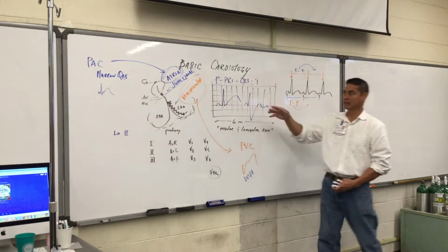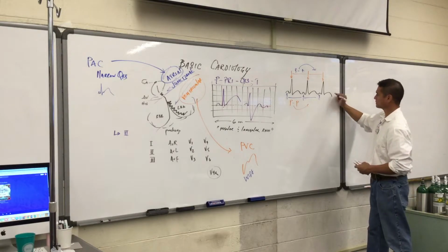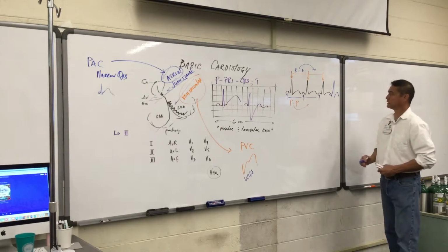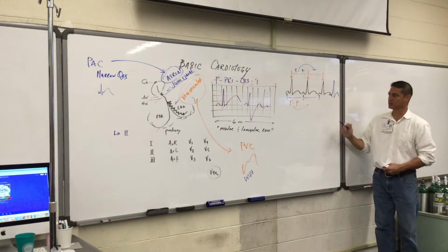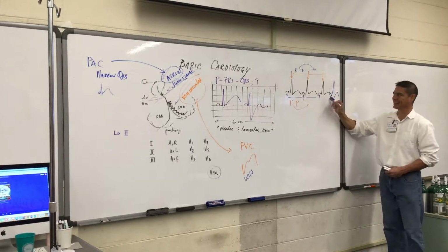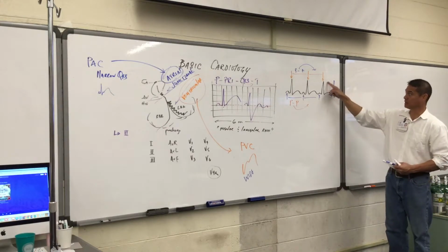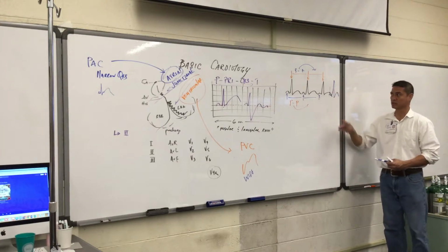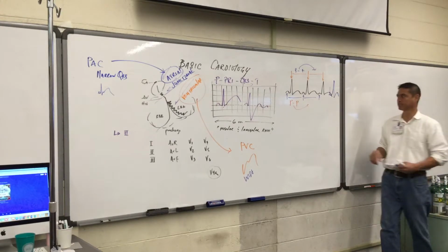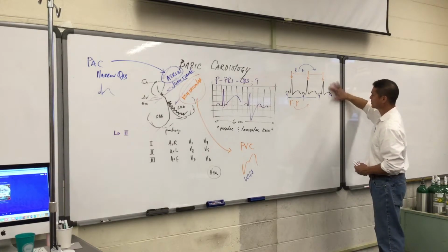So you should have an earlier filling, and you should have an early beat when you feel for a pulse. So every time this irregularity comes on, let's throw in an early narrow beat here. And I drew it here like this because you're looking for a P wave, and what you won't see is that sometimes this P wave is hidden in this T wave. This happens that way. But this earlier beat, the spacing here, because it came from the atria, probably has a pulse originating with it. I'm going to erase this one, and we're going to draw up our ventricular contraction.